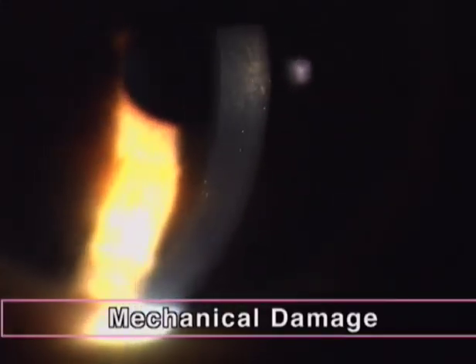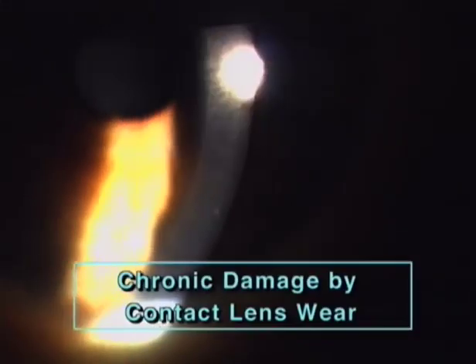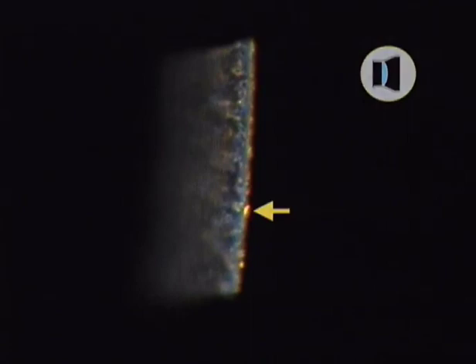A different clinical condition is seen here in chronic damage after prolonged wearing of contact lenses, where we find again numerous small dots in the cornea. When examined with the corneal contact glass, the dots look like white solid bodies of different shapes, shown here in optical section. But in indirect illumination, they are perfectly transparent. The damage does not consist of intraepithelial concrements as one may have supposed, but of tiny cysts filled with semi-transparent fluid.